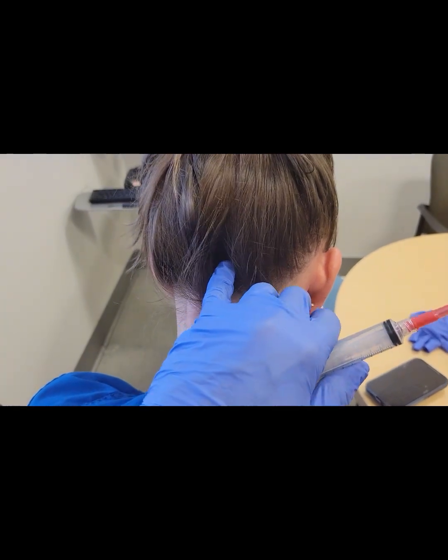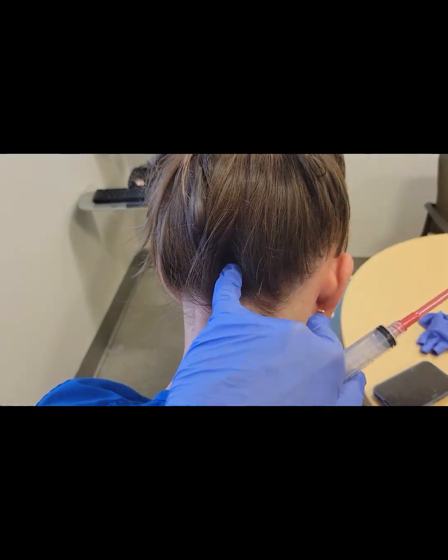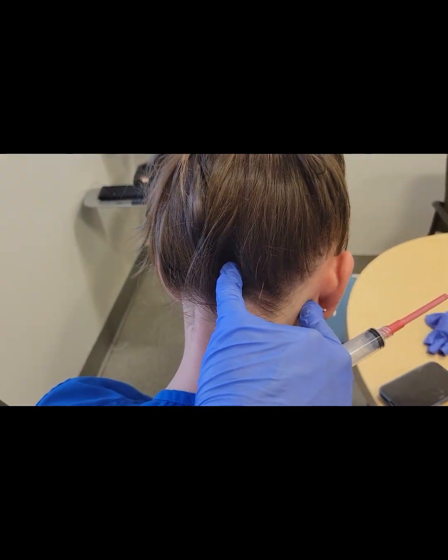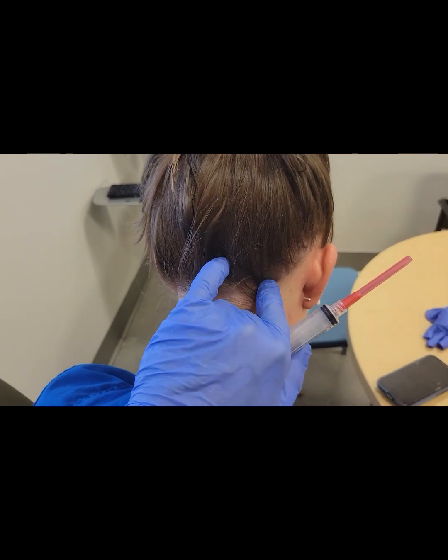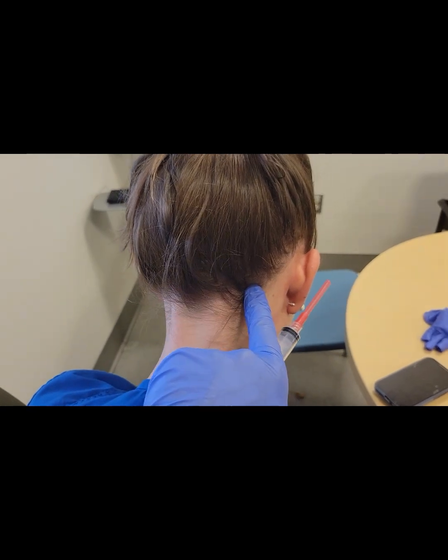Have the patient lie prone with the neck flexed under their chest. Alternatively, you can have them sitting up and flexing the neck.